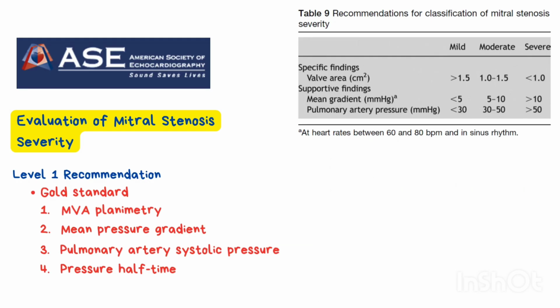Together, these 4 methods give us a more complete picture, combining structure, flow, and functional impact. That's why a comprehensive approach is key in every mitral stenosis evaluation. Each method offers a different perspective: structure, flow, and consequence.